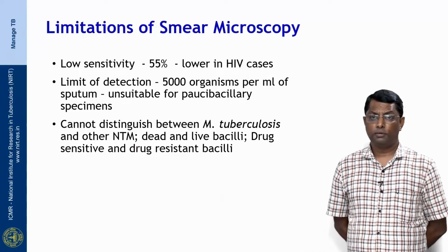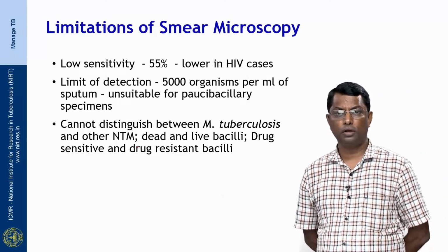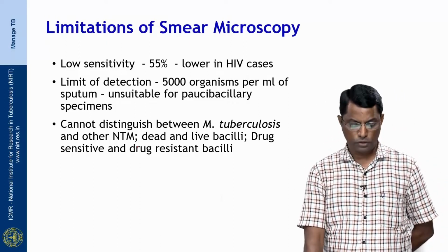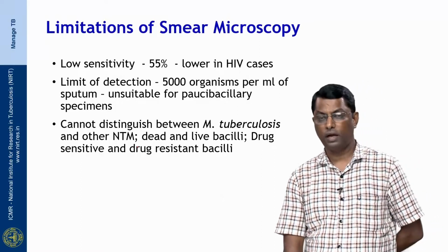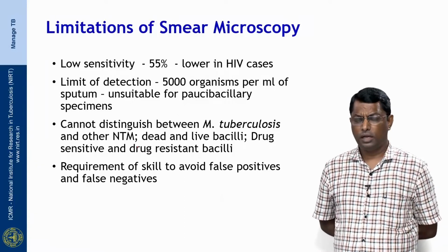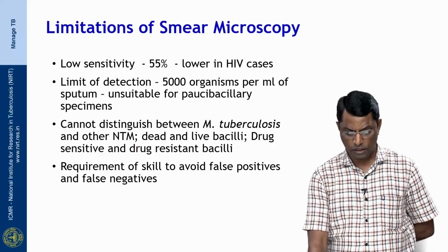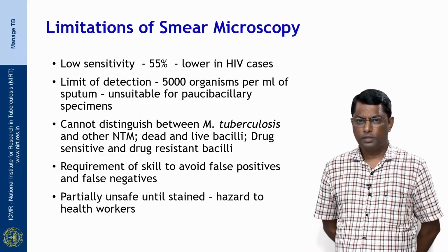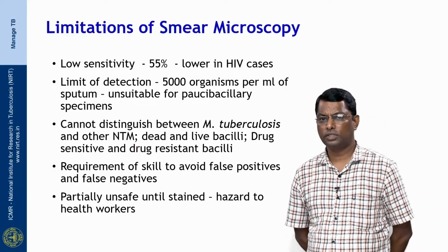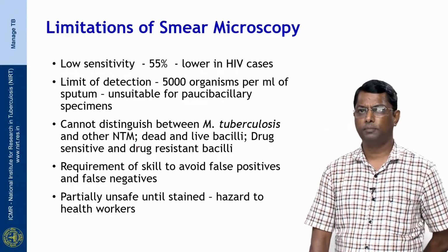Now, it cannot distinguish between Mycobacterium tuberculosis and non-tuberculous Mycobacterium. It cannot differentiate between dead and live bacilli. Of course, it cannot differentiate between drug sensitive and drug resistant bacilli. Now, it does require some amount of skill to avoid false positivity and false negativity, and it is partially unsafe until it is stained, as there are live bacilli sitting on the slide. So, it is hazardous to health workers as well.